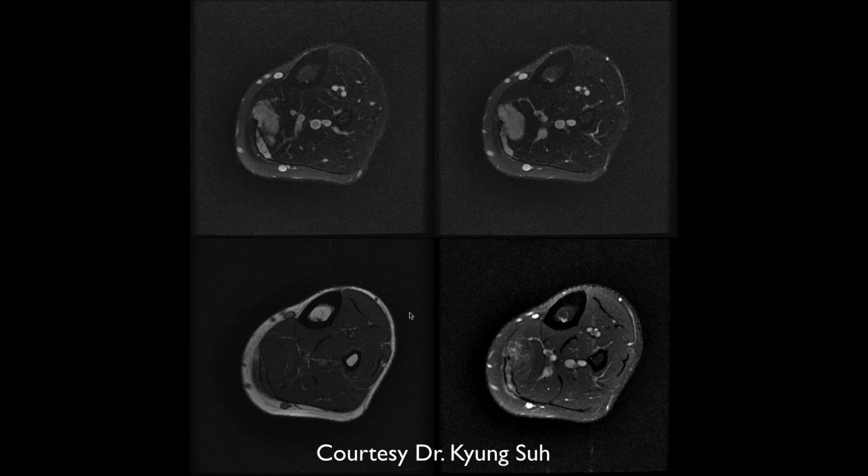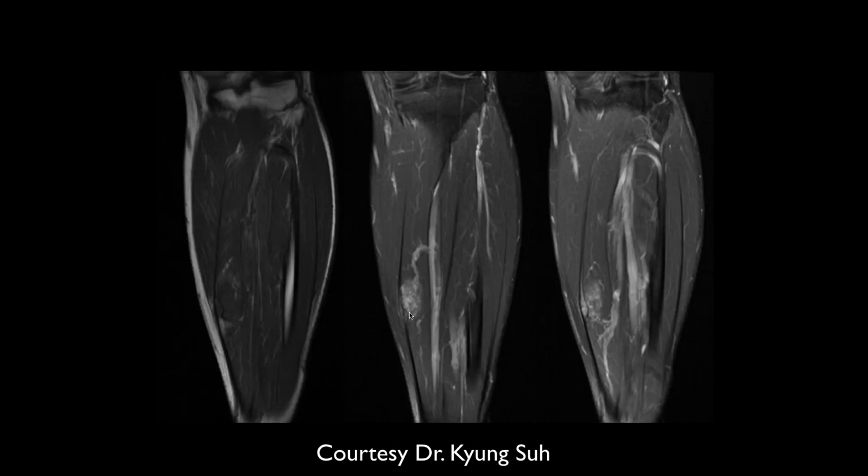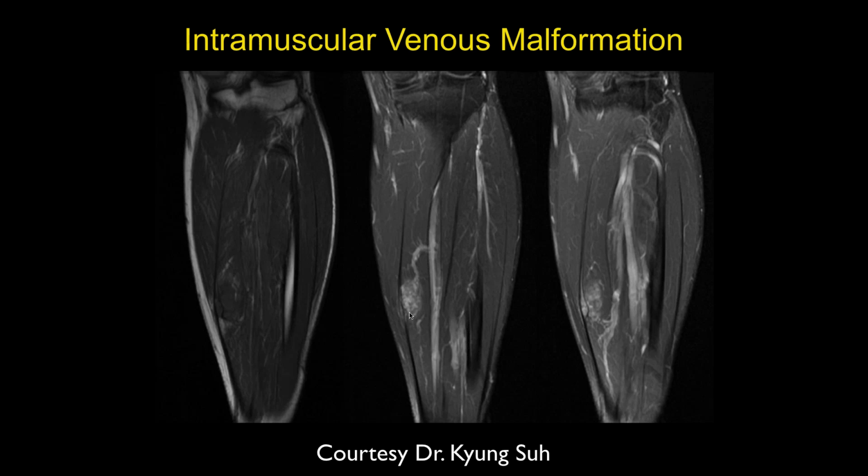That's a pretty big mass for an AVM. Typically with AVMs, you don't really see that. So this turned out to be a mass with a feeder and then a bunch of draining veins. So for this one, you would say still a low-flow lesion, right?